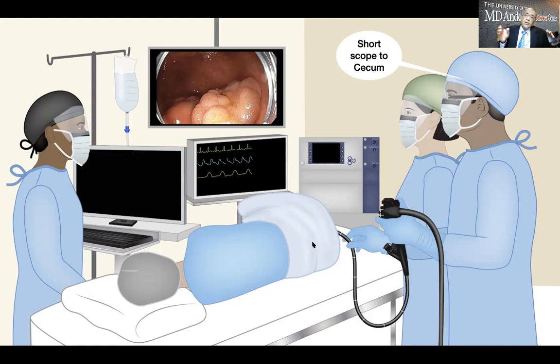And then you should be able to hold that position in that stable position by pressing on the insertion tube to the side of the bed with your thigh, so that you can free your right hand to do whatever is needed. That is something I would suggest that all trainees should practice to reach the cecum, not necessarily fast, but with a short, straight scope. So that is the key thing.